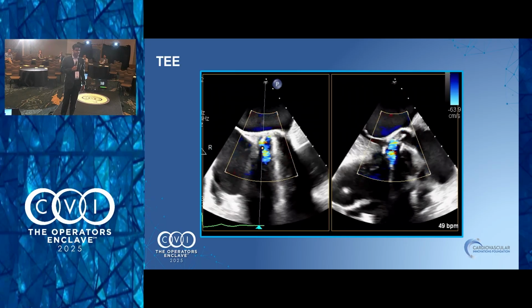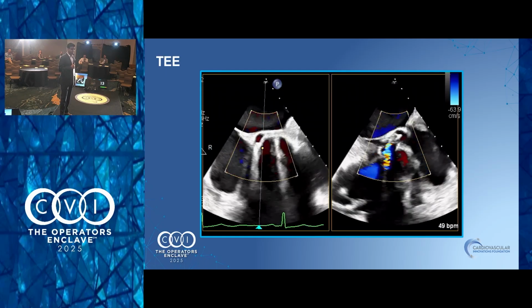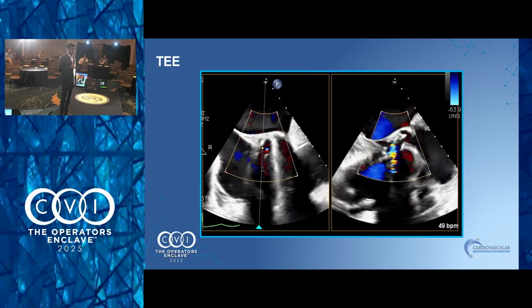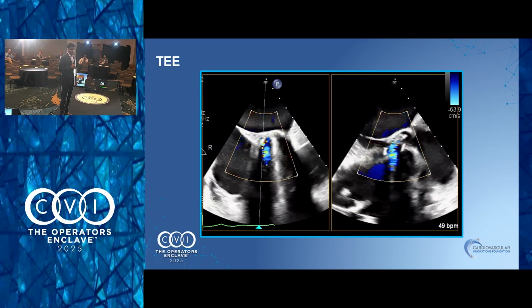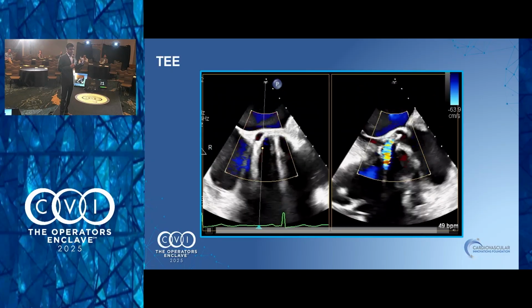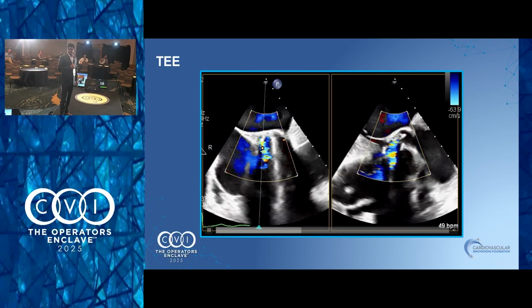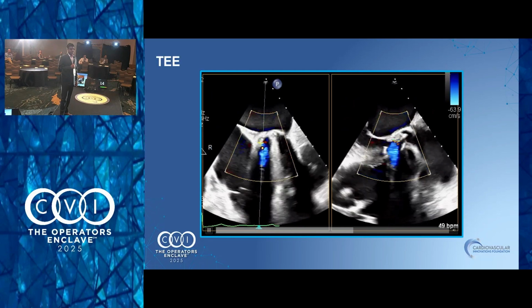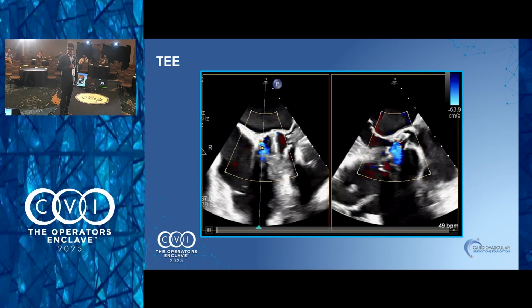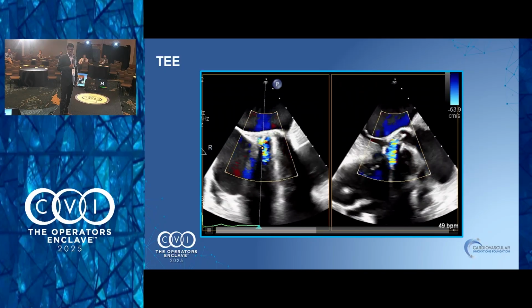If it's a Bentall, it's basically got to be either at the level of the valve or at the distal anastomosis. So it's got to be somewhere down there, but exactly where nobody knows. I thought it was right at the valve, because on the CT it's right close to the valve. So it has to be somewhere it was sutured close to. I would try an aortogram also. We've done those before, like a full-strength aortogram, pretty much blast that aorta and try to see where it fills. Try to start building some relationship there.